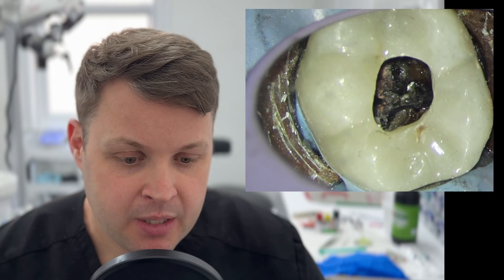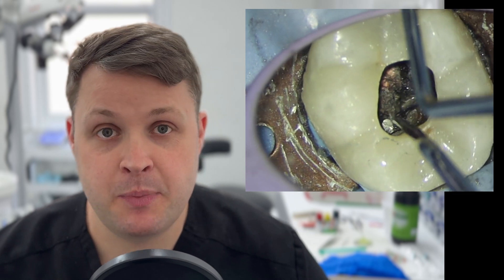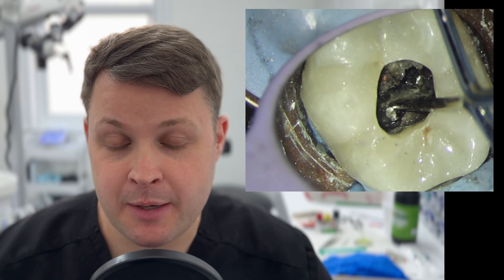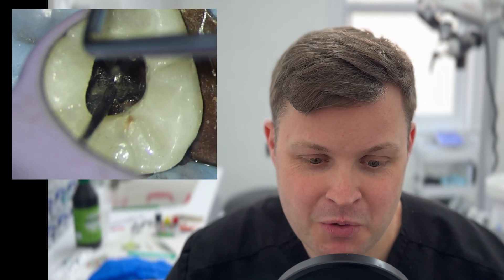When you look at these types of cases, especially if you are a less experienced dentist, you might think that this tooth is absolutely completely unrestorable and you'd never take a case on like this. I hope today, if you're a budding endodontist, I can give you a few tips on how to remove these silver points. I was taught to get some really strong locking tweezers to pull these out.